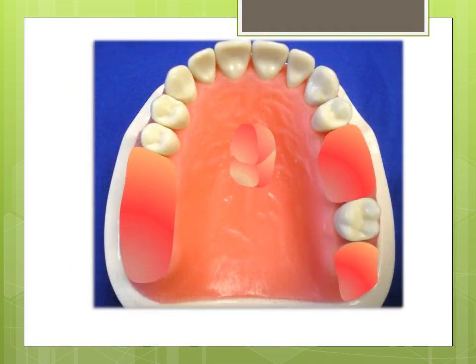Our patient is presenting today with a partially edentulous arch. She would like to replace the missing teeth if possible. Her dentist has informed her that due to maxillary tooth loss, her mandibular teeth could erupt further, making her situation worse. She has a Kennedy Class II Modification 1 arch form.